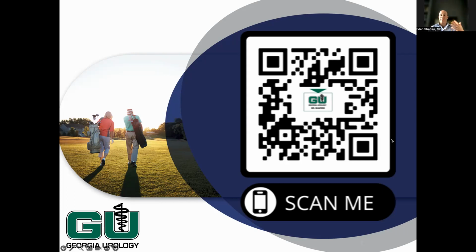There used to be stents. There are new stents that are trying to get around this by having them elute certain medications. But the concern is that you get encrustations and then it becomes challenging to remove, and it may cause more issues than good. There are newer ones that are coming out. There have not been any that have been FDA approved which have really come to the forefront as first-line treatments. But I think the jury is still out on whether stents may be used again, I should say, in the future.